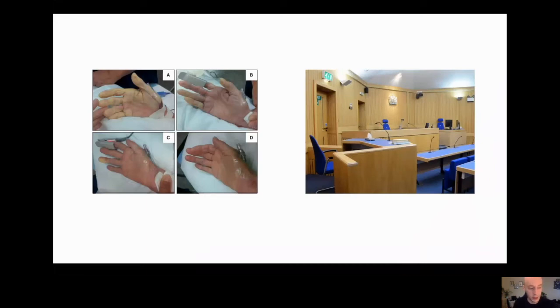I think what is important is that you maintain a high degree of suspicion. And in that case, I didn't put anything down it. I stopped, I took a gas. The gas had really high sats, and I thought, okay, it's definitely arterial. And I took it out and the patient was fine.